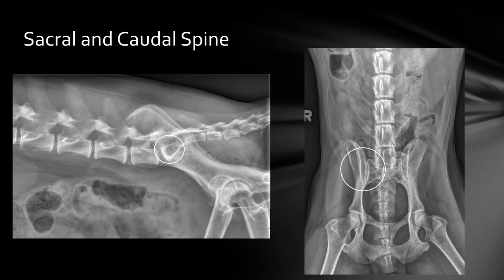In fact, of the sacrum, you only see the body of the sacrum here. On this lateral view, you really do not see the wing. The wing probably corresponds to this circle here. And where it articulates with the ilium, this will be an area of ill-defined increased opacity superimposed here, and likely is the reason why this area often looks a little bit abnormal, even though it is not.